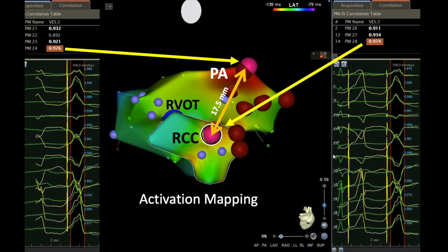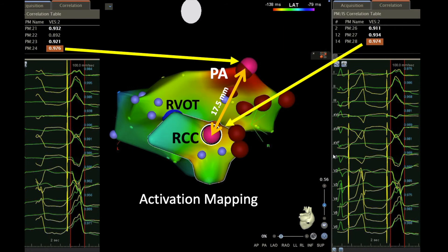At this location, the ablation was successful, but we had recurrence after one to two minutes after ablation. Therefore, we went back to the right outflow tract and at this time we started mapping the pulmonary artery. Finally, we found the earliest point in the pulmonary artery with a pacemap of 97.6 percent and an activation around minus 40 milliseconds, and ablation at this location was successful. It is very interesting in this case to see that we have two pacemaps around 97-98 percent, one in the right coronary cusp and the other one in the pulmonary artery, and the distance between these two points was 17.5 millimeters.